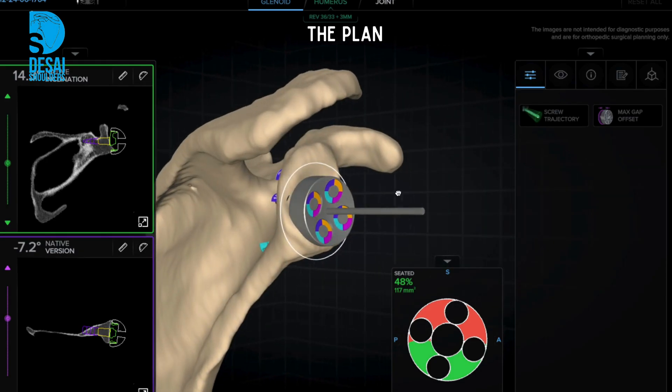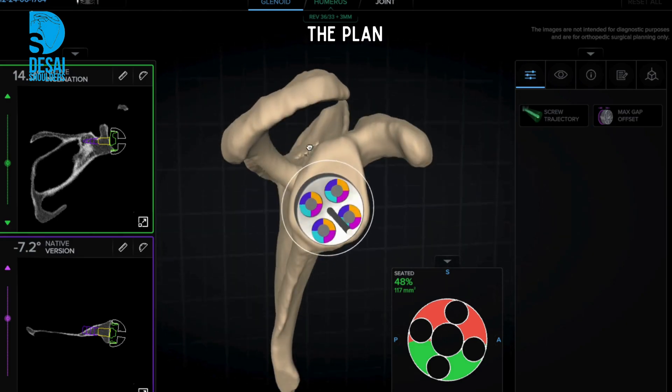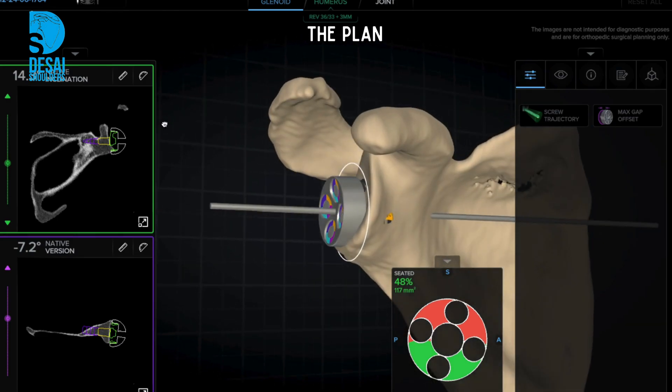The central pin implantation 3D guide will be calibrated to allow accurate intraoperative pin placement. The screw sizes are already calculated.